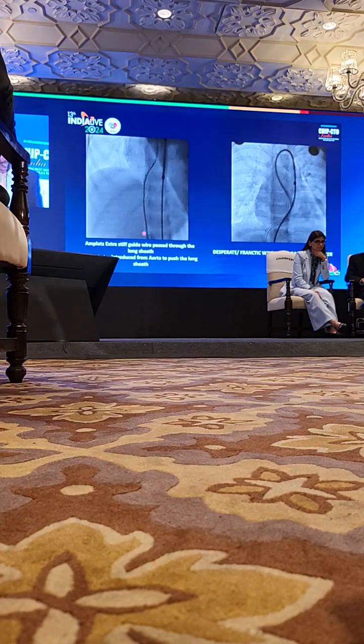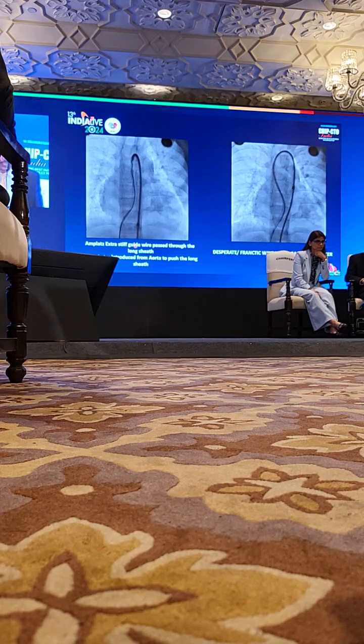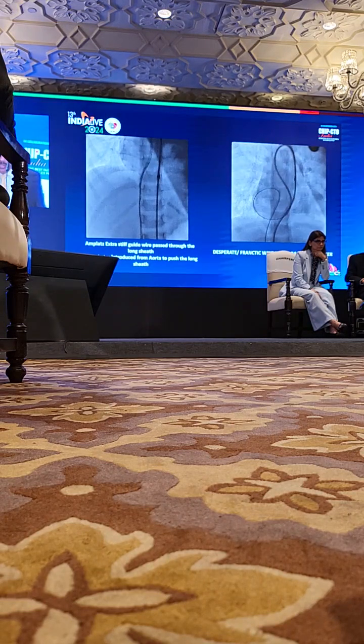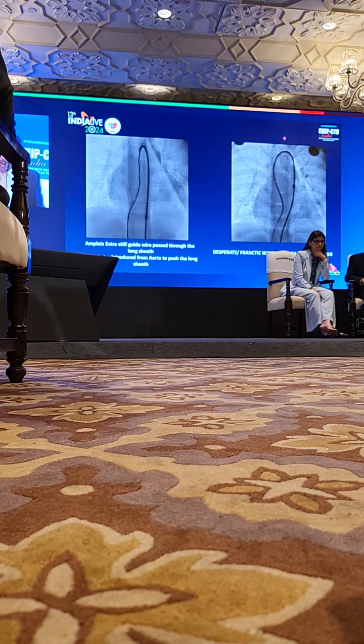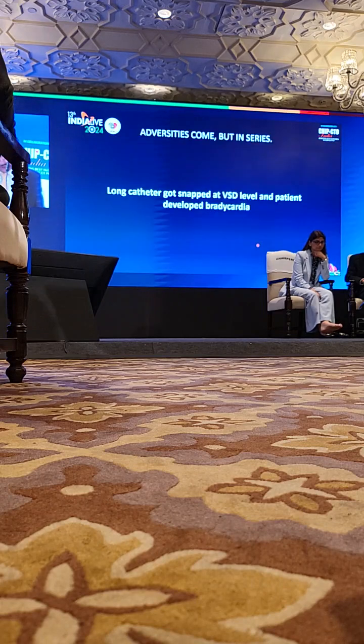I tried to pass an Amplatz extra stiff wire through the long sheath, and an MP catheter was introduced on the aortic side just to push the catheter and see if something could be done. So it was all desperate measures. Here you can see I've got the MP catheter almost till the VSD level, but it would not release that. So this was the situation we were in.